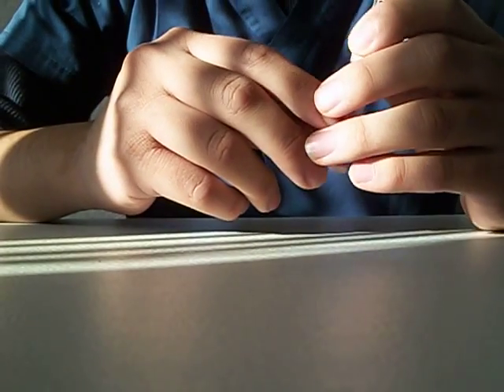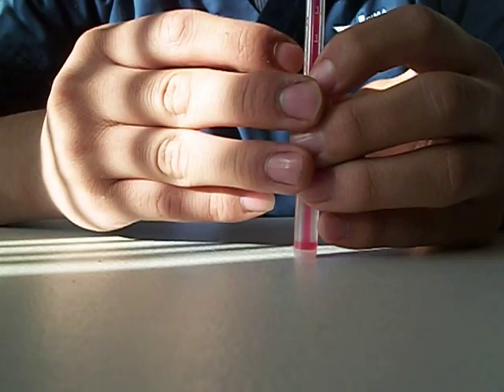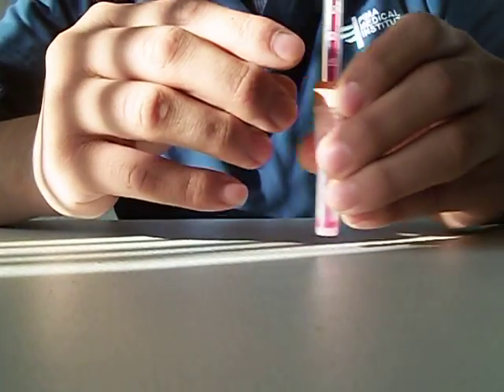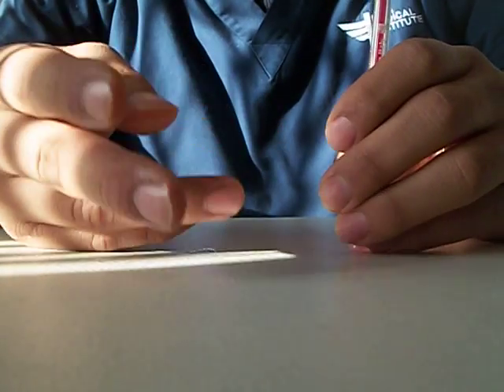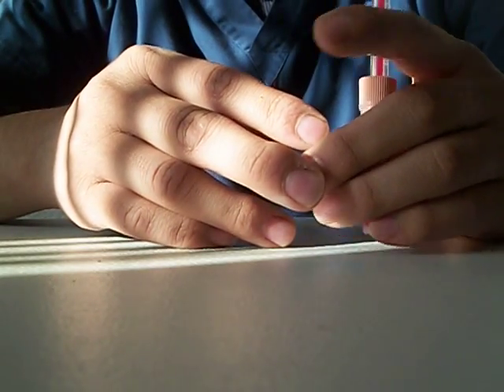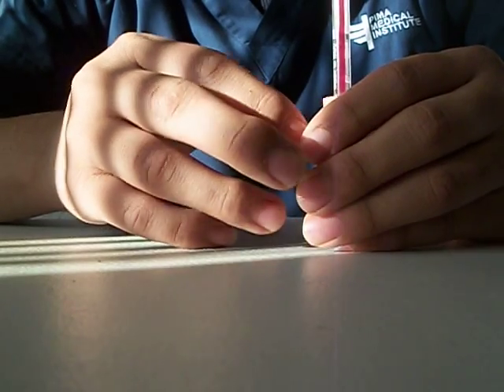When filling this tube you want to avoid bubbles because bubbles can affect the result. After you have everything like this — the name, the initials, and the time — you can put it in the rack and then wait for the result in an hour. And it's pretty much that. So this is how you perform an ESR test. Thank you.